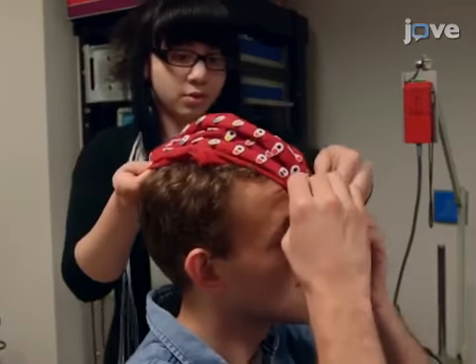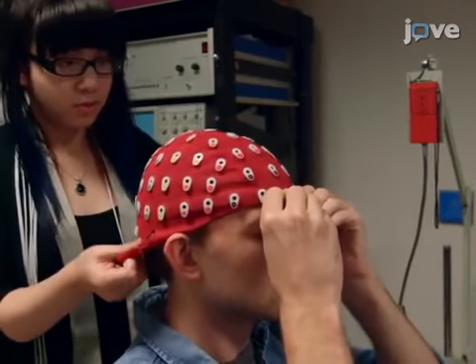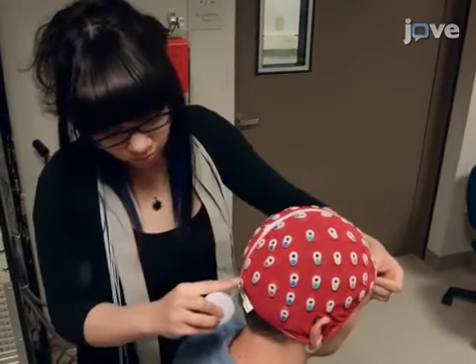Place the EEG cap on the head using the predetermined vertex CZ as a reference location. Align the cap on the head based on the modified 10-20 system.